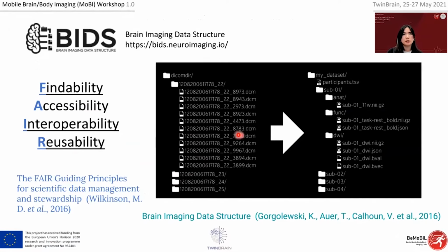On this side, I have no expertise in fMRI, but this is the structure of data files right after data collection. So what I can tell from this is that I cannot tell much from it. There isn't really a clear indication of which files they are and what they contain.